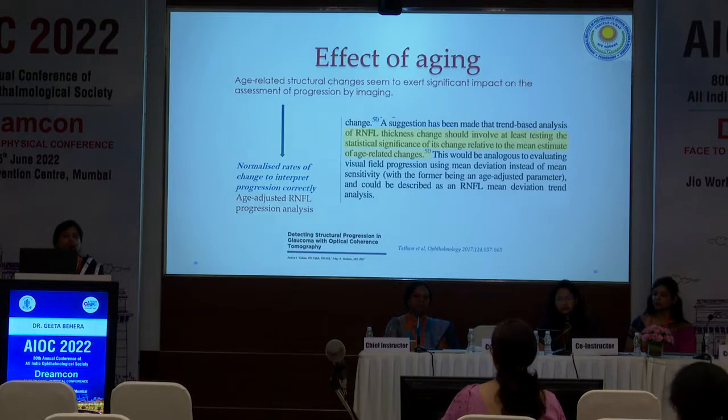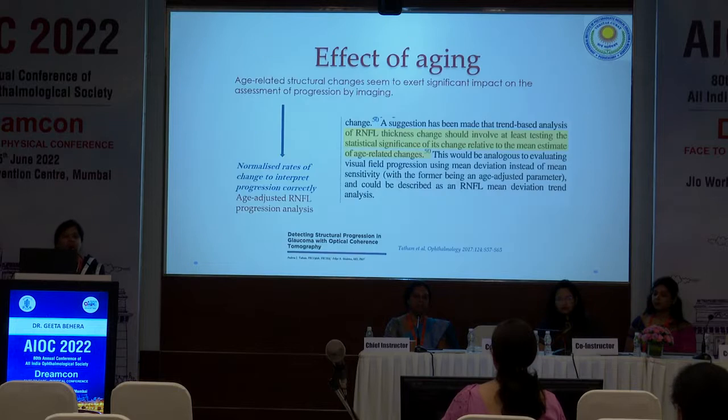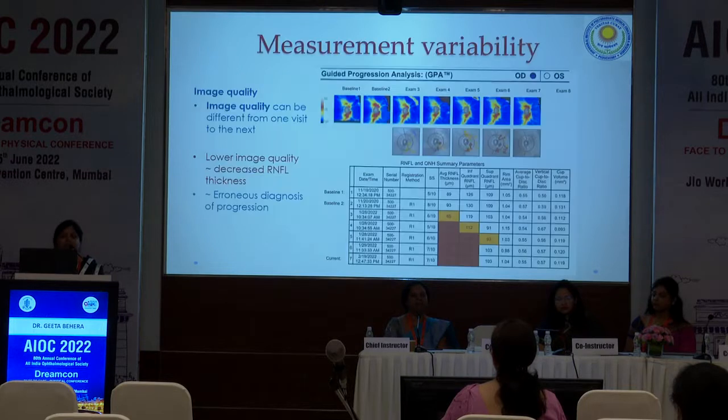Because of the effect of aging, it is now suggested that we use age-adjusted RNFL progression analysis, but unfortunately, this is not there currently in any of the devices. This is in development. Now, the next part is measurement variability. Image quality is a very important source of error.